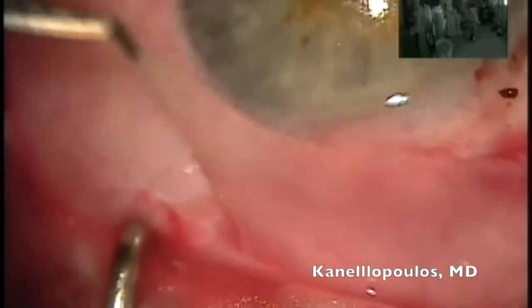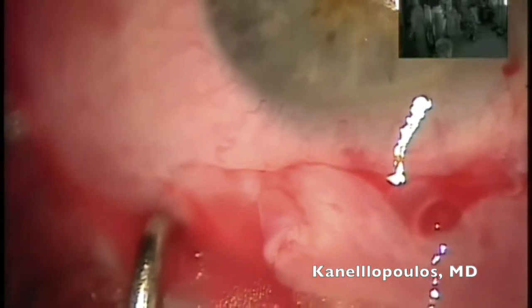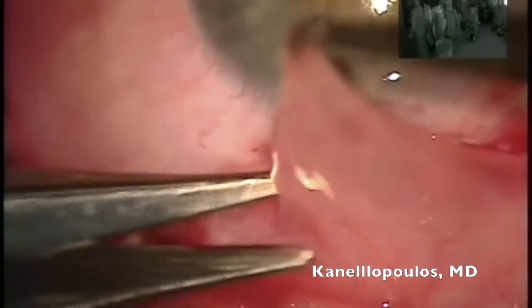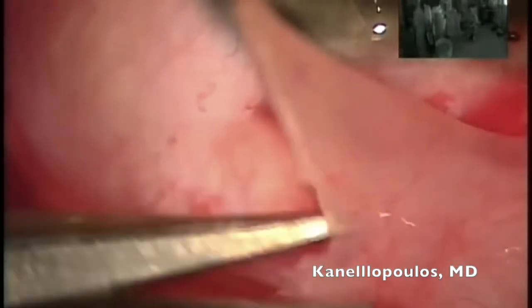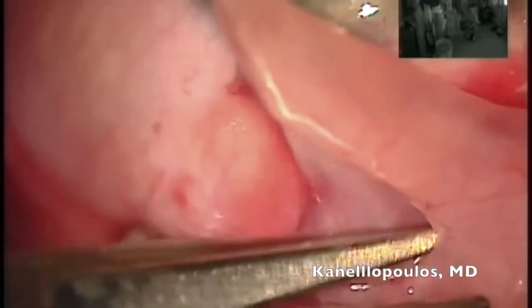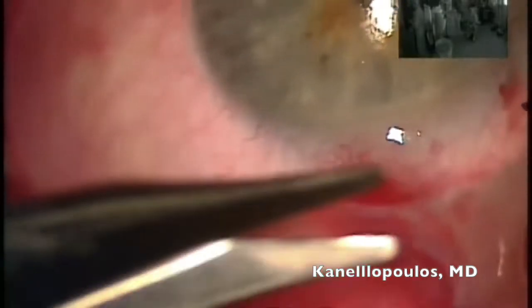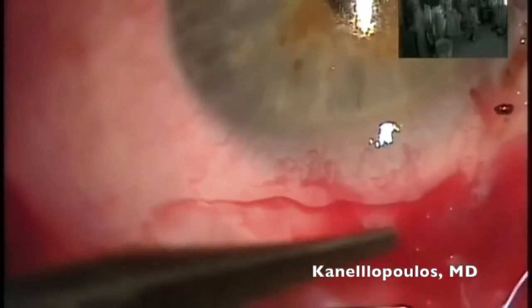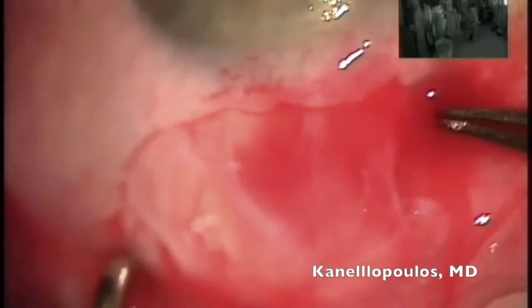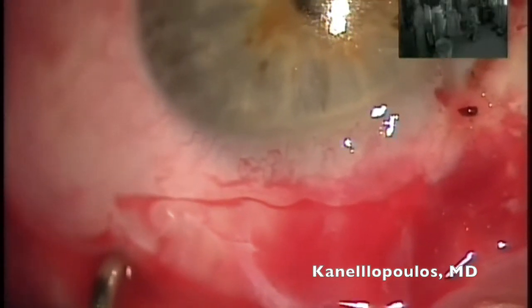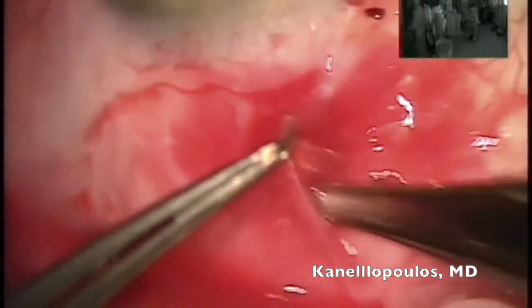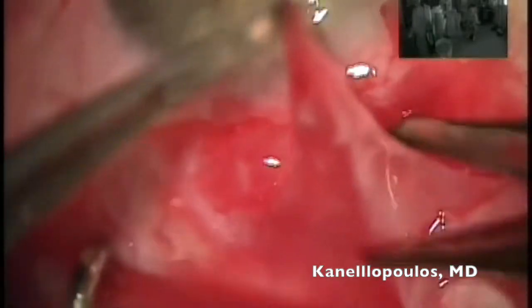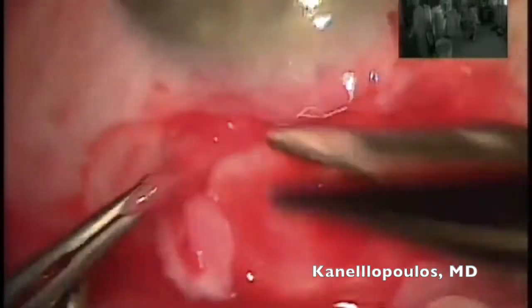Traditionally, the way I trained — both in New York and Boston — was to harvest an independent piece of conjunctival autograft from the superior part of the eye, non-exposed to the elements and sun, and then do a free graft onto the area where the conjunctival deficit from removing the pterygium exists. I'm separating my graft from Tenon's capsule and removing Tenon's as well. Special care, obviously, not to damage the superior rectus extraocular muscle. I'm going in with my blunt Westcott scissors to trim Tenon's — the reason being to reduce the chance of hematoma and improve hemostasis.